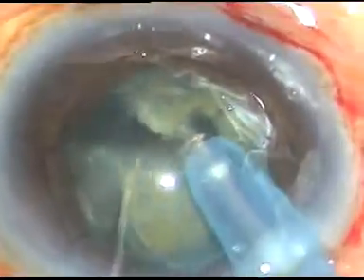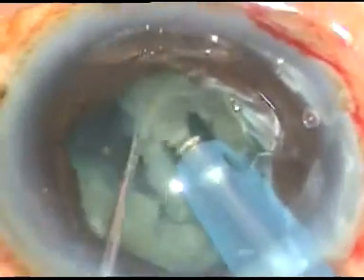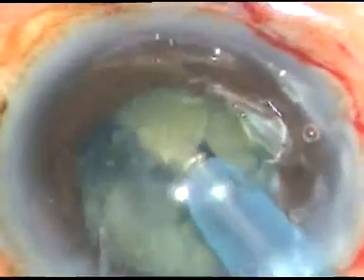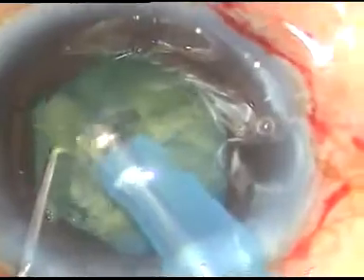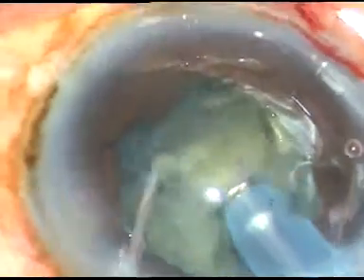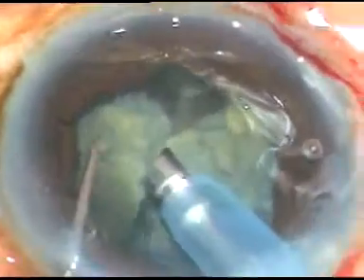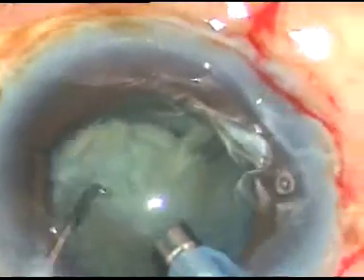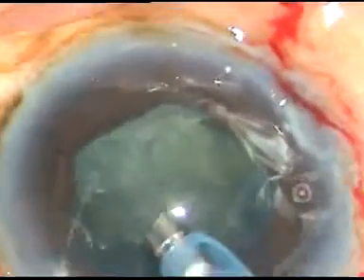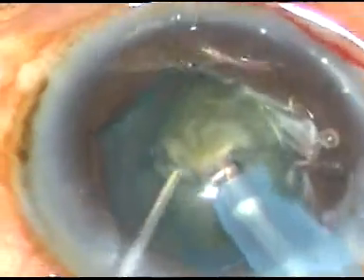This is a brittle nucleus and chopping is becoming very easy. I chop the nucleus into several fragments, and after chopping, I draw each fragment to the center of the anterior chamber and emulsify it. Always pull the pieces to the center and emulsify at the center, because at the center of the anterior chamber the depth is maximum and the posterior capsule is also at the farthest distance. This is the last portion of the nucleus.